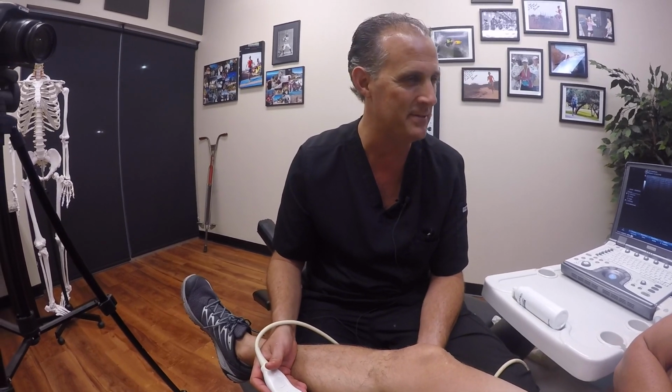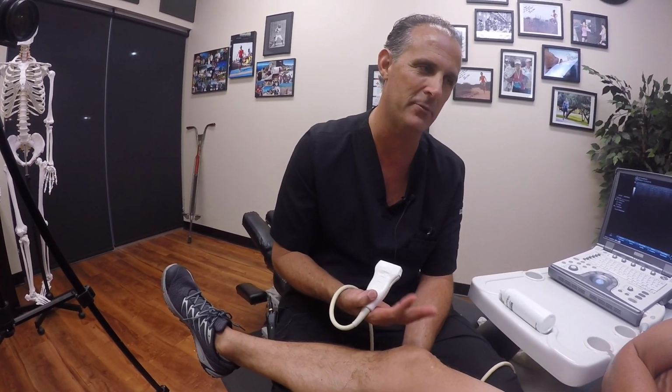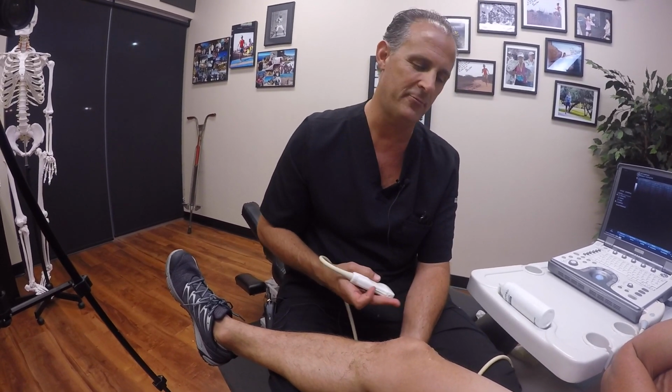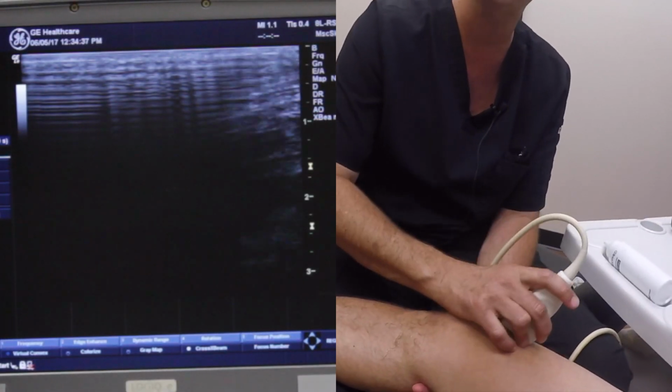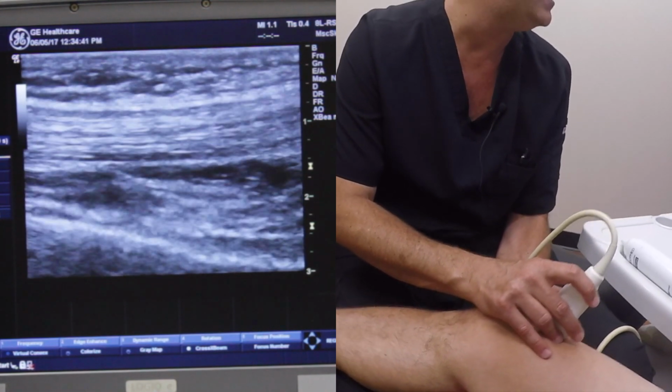Another possibility is we know that Dr. Sebastian's aggressive with the sport. He plays a lot of baseball. You're playing it. Yeah. So he's sliding. He's playing pretty aggressively, and you just played over the weekend. So the fluid in this knee could come from just an already weakened knee out here, and now there's some trauma going on and sliding around. But it's definitely not something that we see every day.